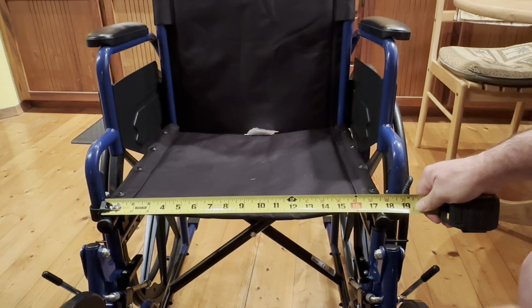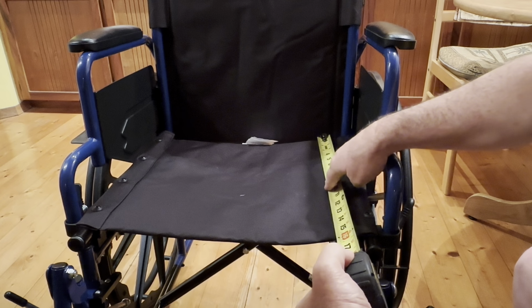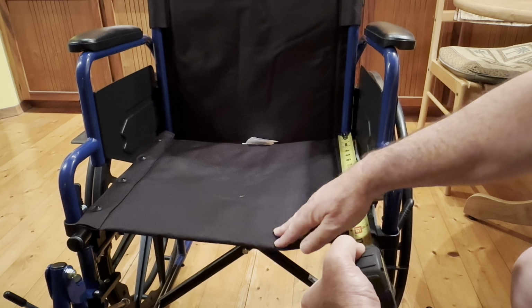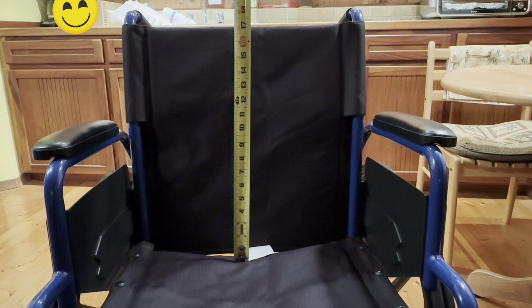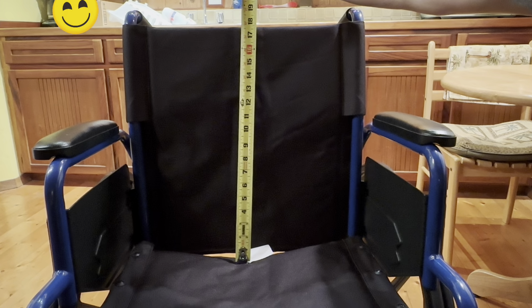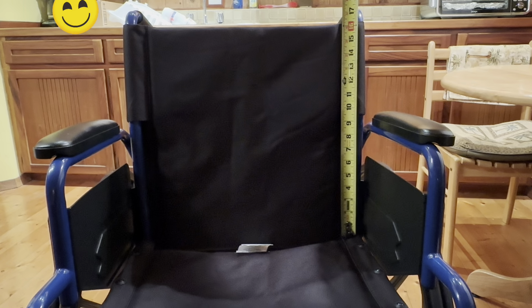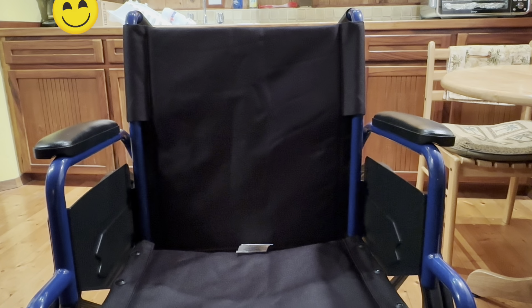This seat is 18 inches wide from the outer dimensions, and the depth, measuring from the padded seat here, from back there to up here, is almost 16 inches, not quite. Screws all along each side, so you could potentially replace this pad if you needed to, if it got damaged or dirty. Let's measure from the middle of the seat to the top of the back is 17.5 inches, about there. From the edge of the seat where the bar is to the top of the backrest is about 16.25.